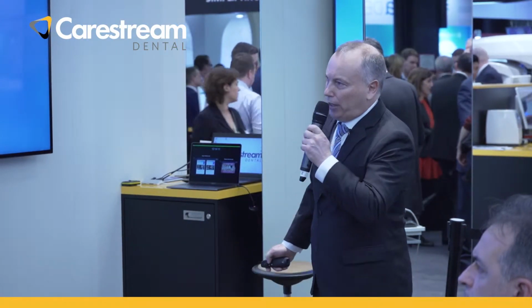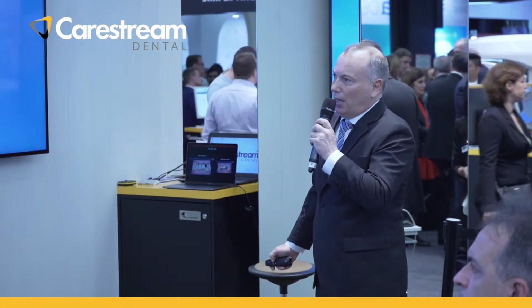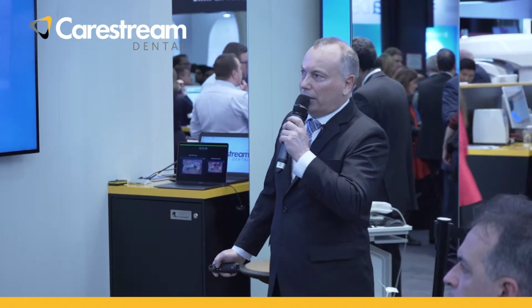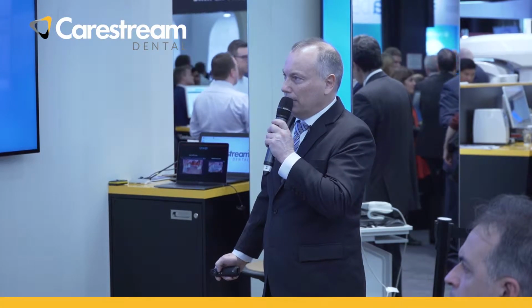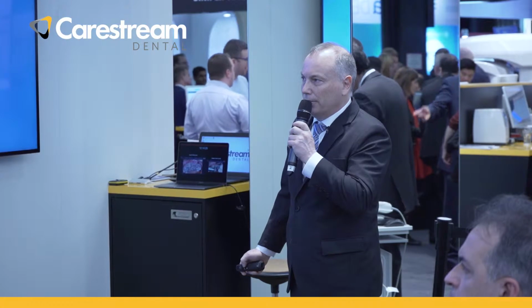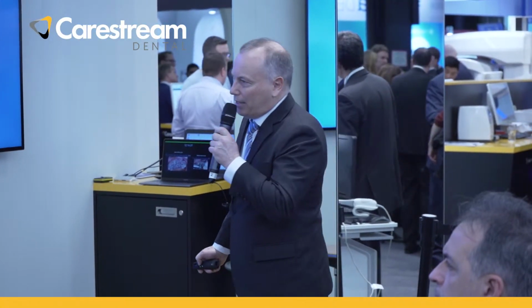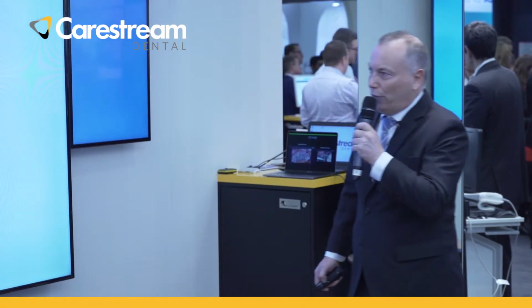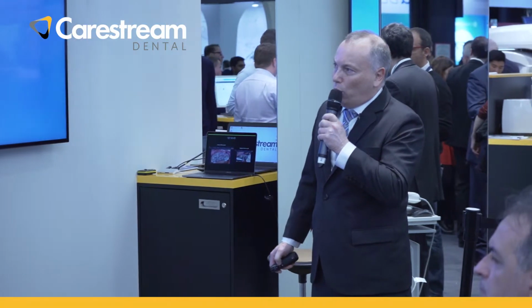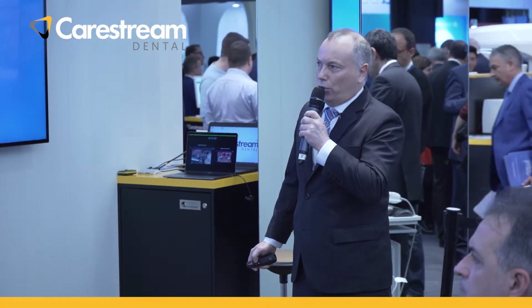This is the surgery protocol, and now we go to the surgery. Starting situation, and then extraction of the 2 teeth. We have the template placed inside. We can really check the teeth well because of the skeletal design of this template. We have a good visibility, and we can also rinse when we do the surgery.